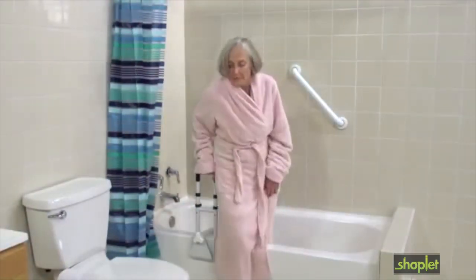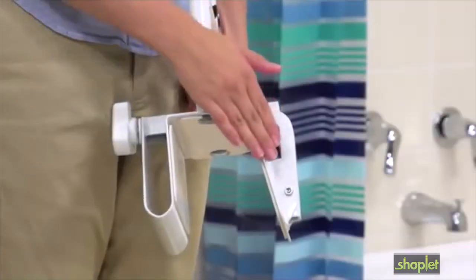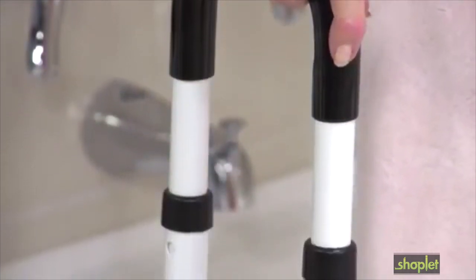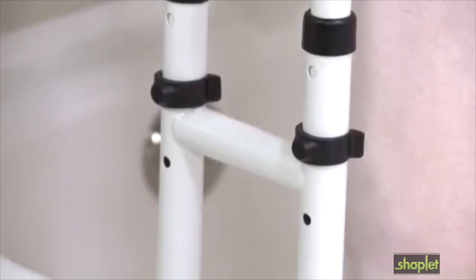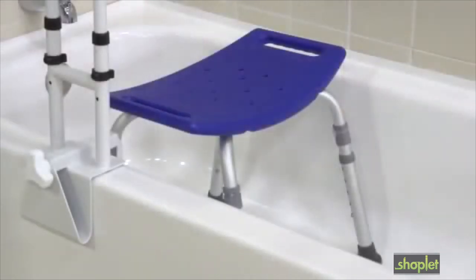This also helps people avoid losing their balance by having to lean over to grab the rail. The clamp adjusts from three to seven inches, fitting most bathtubs. This padded curved handle makes it easier for users to get a secure grip even with wet hands, and the steel frame is durable and easy to clean.